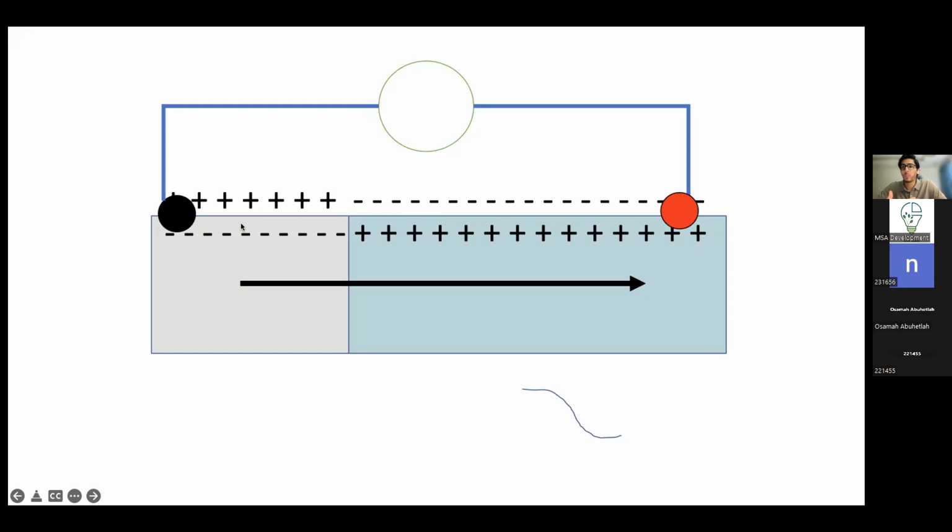So the wave of repolarization, with an R, is spreading from here to here. So if the wave of repolarization spreads from the negative to the positive electrode, the deflection, or the change of the isoelectric line, the change of the horizontal line, is going to be downwards. It's going to be opposite, right? It's logic. If the wave of depolarization that happens towards the positive electrode causes an upward movement of the line, the wave of repolarization that happens towards the positive electrode will be causing a deflection that is in the opposite direction, which is negative, right? So this is what I mean by here.